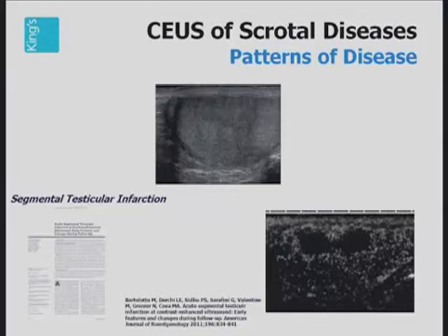You should be able to see a single bubble traversing a blood vessel in the testes, not because that bubble is so big, but the reflection of ultrasound allows that bubble to be tracked. If the bubble moves across the field of view, that area is vascularized. The microbubbles are truly intravascular and do not leak. This is a very important point to understand. This is not like contrast-enhanced CT. It clearly shows an area of vascularity.